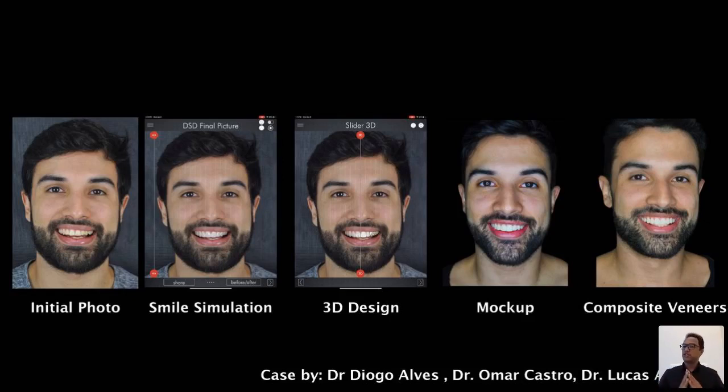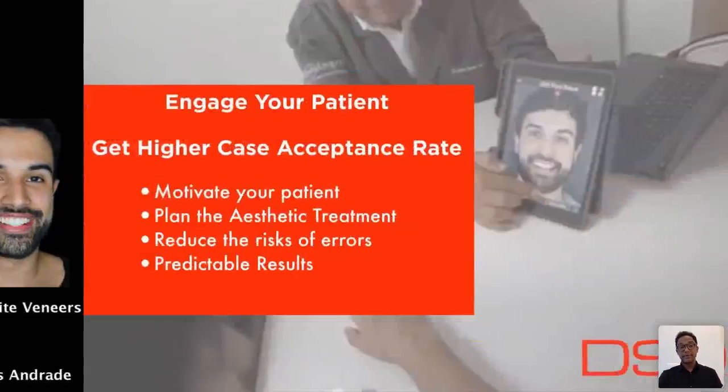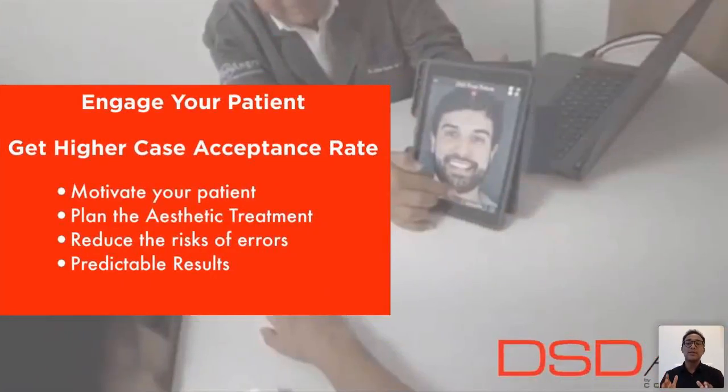And then the patient loved it, approved it, and we created 10 composite veneers within one session. Everything done with DSDApp.